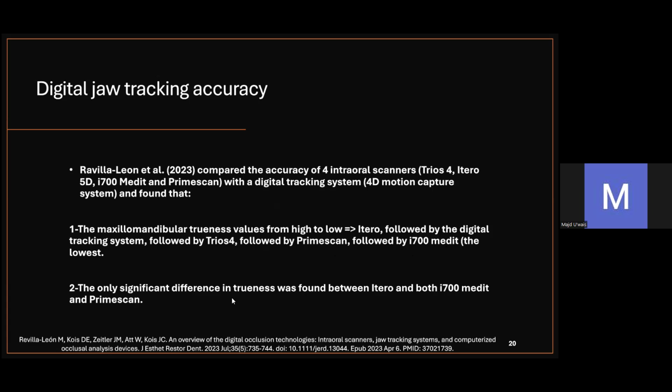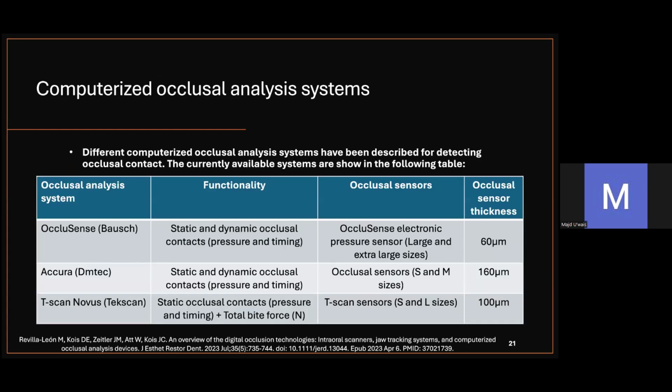The only significant difference in trueness was found between iTero and both i700 Medit and PrimeScan.